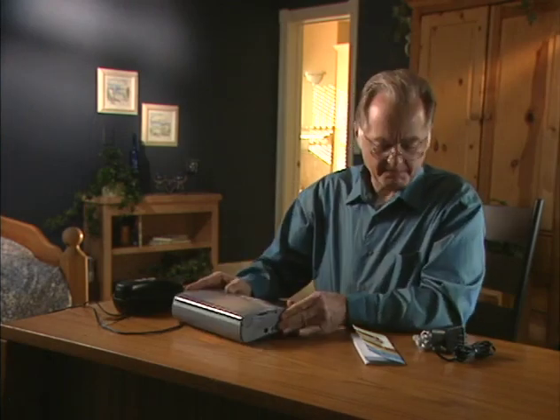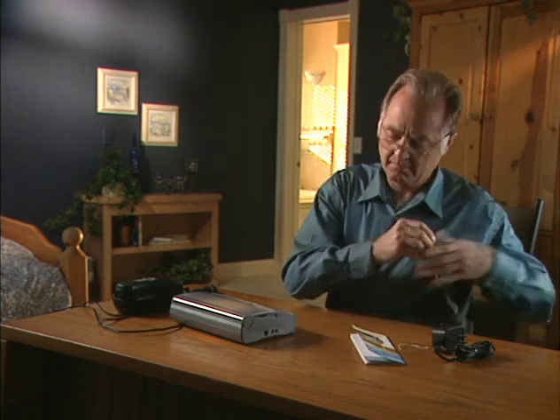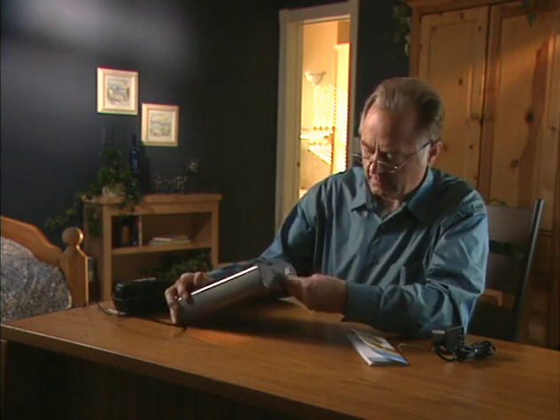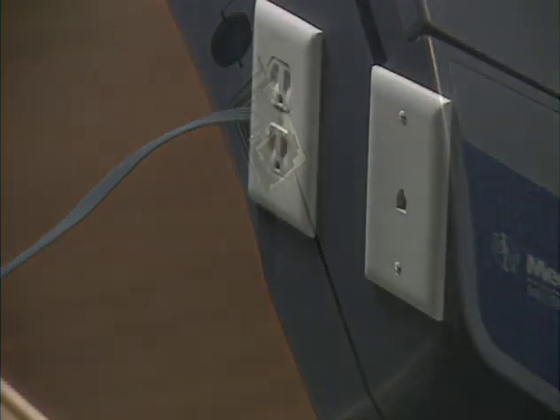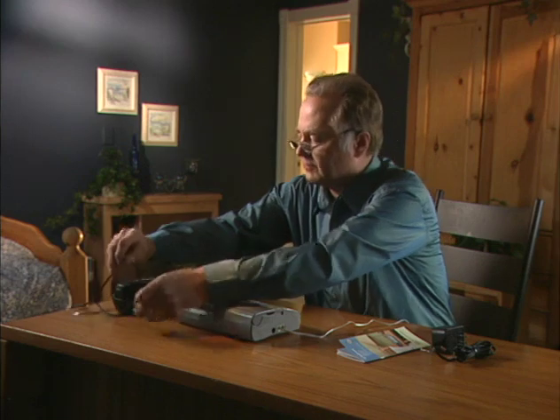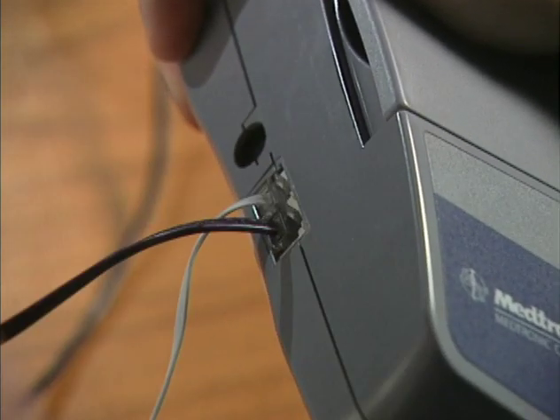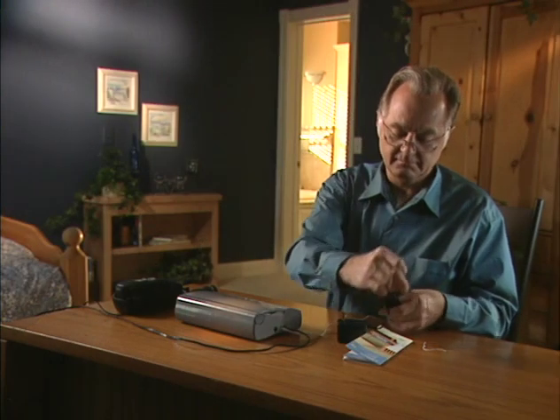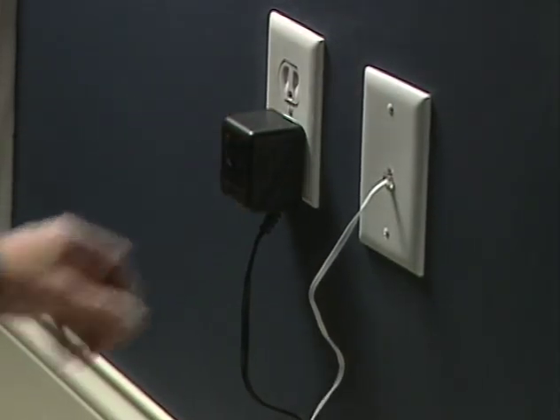Now locate the telephone plugs on the left side of the Medtronic CareLink monitor. Take the telephone cord out of the monitor case. Plug one end of the telephone cord into either of the telephone plugs on the left side of your monitor. Plug the other end of the telephone cord into the telephone wall jack. If you want to use both the monitor and the telephone, plug the cord from your telephone into the other telephone plug also located on the left side of your monitor. Find the power cord port on the left side of the monitor, plug one end of the power cord into the monitor, and plug the other end into the power outlet in your wall.